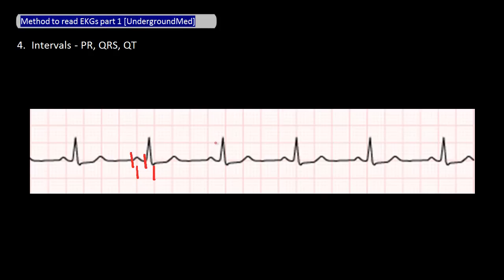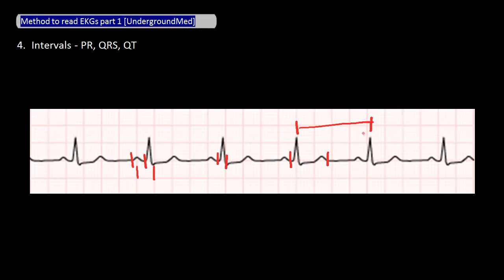Next, moving from left to right, look at the QRS duration — it should be less than three small boxes wide. Eyeballing it, we can see that it is less than three small boxes wide. Continuing to move from left to right, the last interval to check is the QT interval. An easy way to determine if the QT interval is prolonged is to see if it is more than half the R-to-R distance. Eyeballing it, we see that the QT interval is less than half the R-to-R distance, and thus is not prolonged.